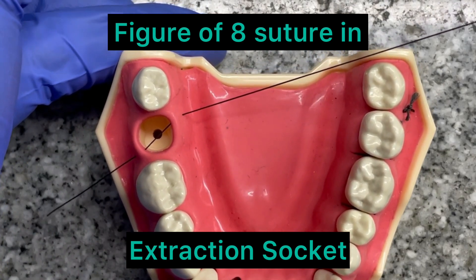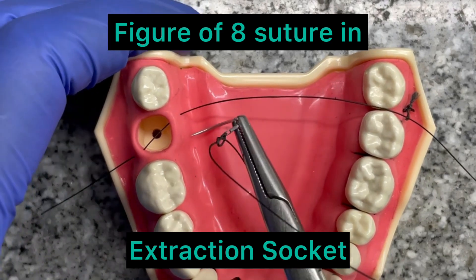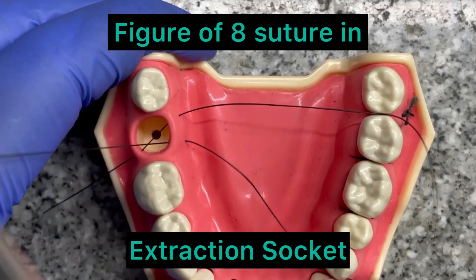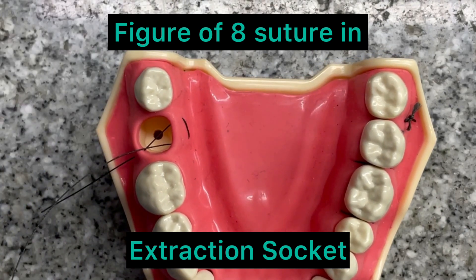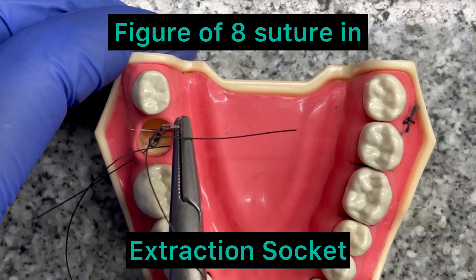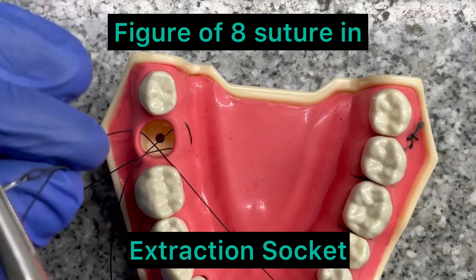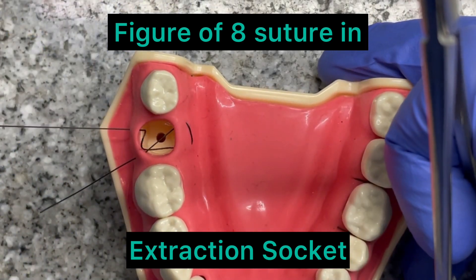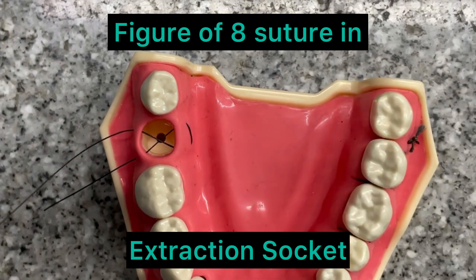Be careful about the loose end. Going to the third point of entry — here you will appreciate the figure of eight even more because you will be able to see it very clearly. This is the fourth entry; you have to go a little deep. Can you see a good figure of eight inside? Now you will tie a knot here.